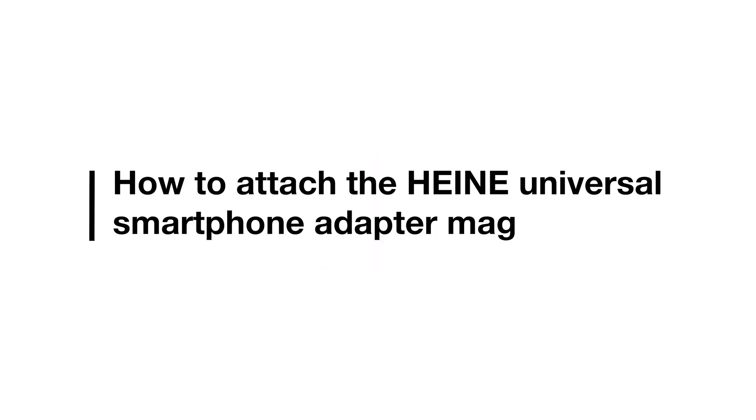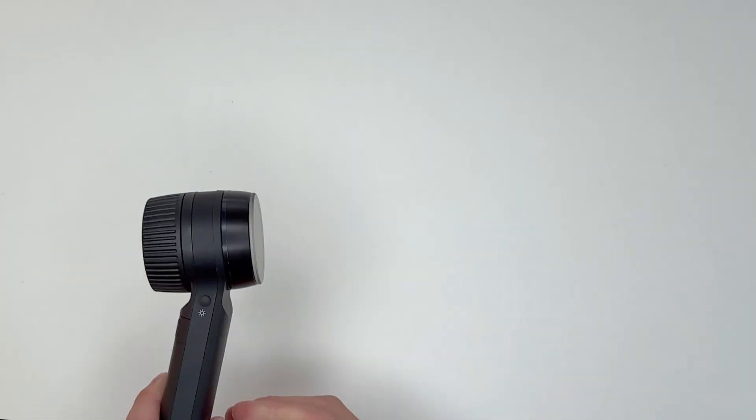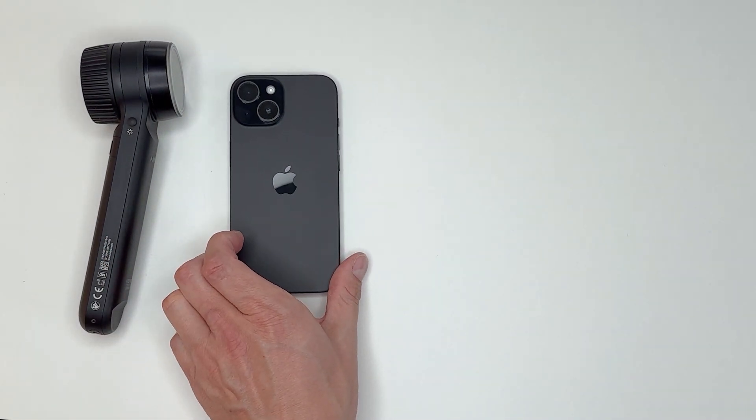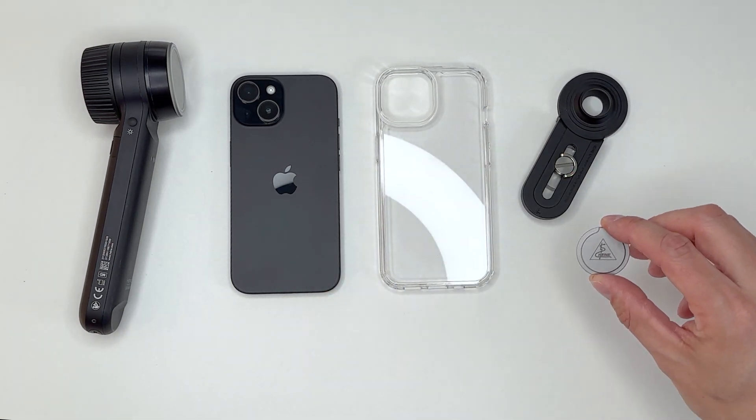In this video, you will learn how to attach the Heine Universal Smartphone Adapter mag to your smartphone. You need your Heine Dermatoscope, a smartphone, a suitable hardcover smartphone case, and the Universal Smartphone Adapter mag.